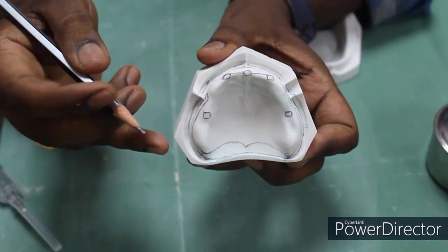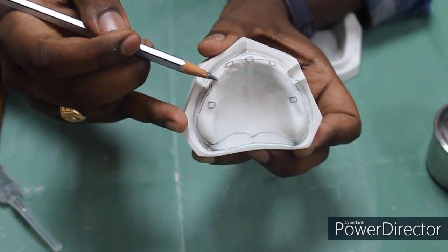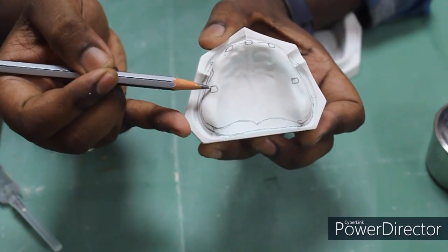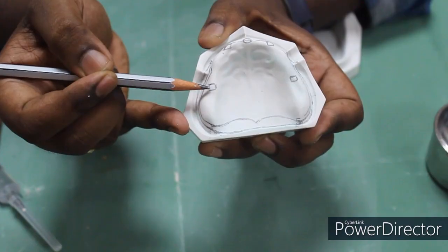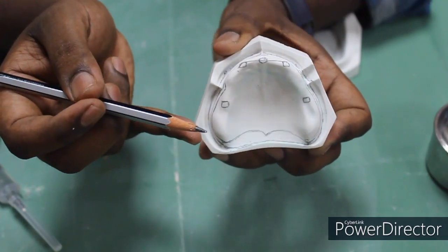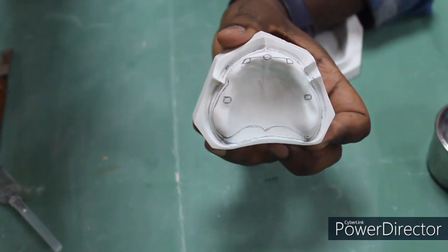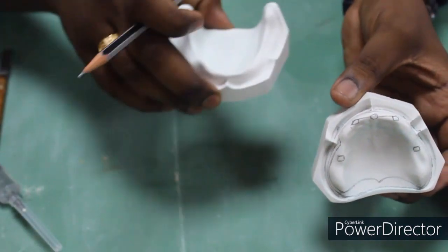Now you can see there are 2 stoppers in the canine region bilaterally, one on this side and one on the other side, and in the same way 2 more stoppers in the first molar region. So this is the design outline for the maxillary cast. Now we are going to see the mandibular cast.